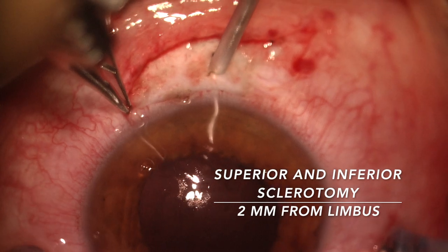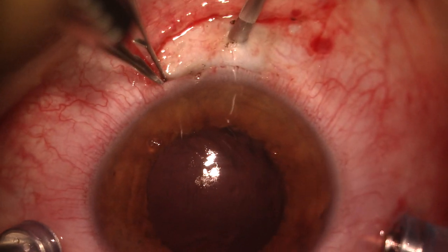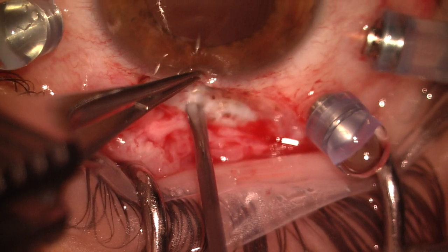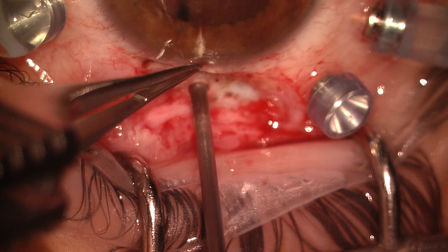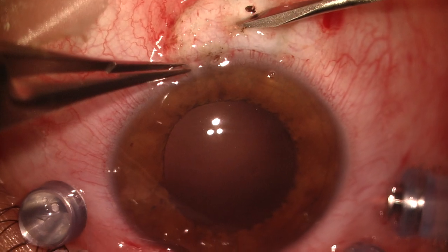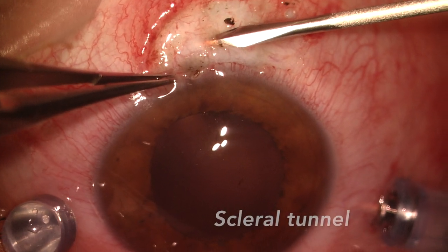Two sclerotomies, 2 mm from the limbus, are made using a 20-gauge trocar. A scleral tunnel of 4 mm is then performed parallel to the limbus.